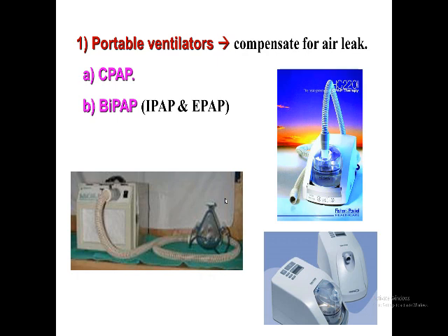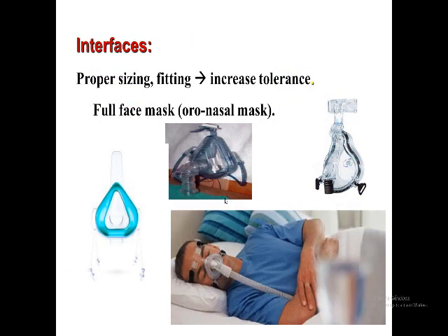In portable ventilator, there are two modes. I may use CPAP, which is continuous positive airway pressure, or BiPAP, with IPAP and EPAP, inspiratory positive airway pressure and expiratory positive airway pressure. I use either this or this.